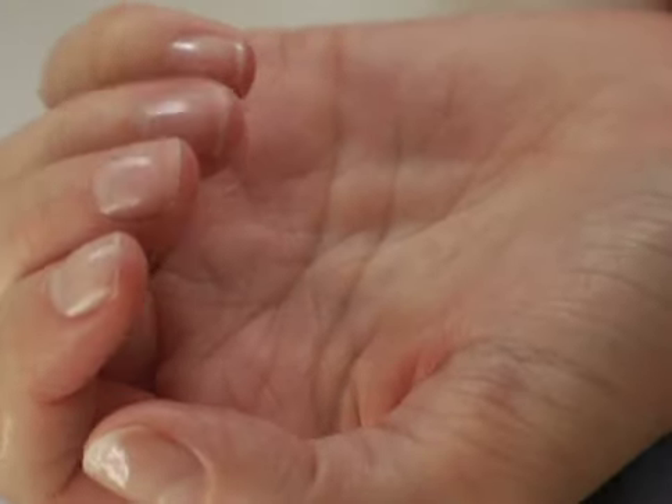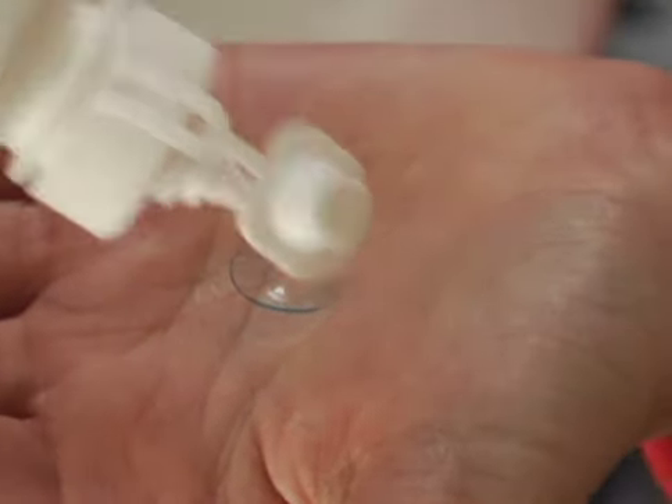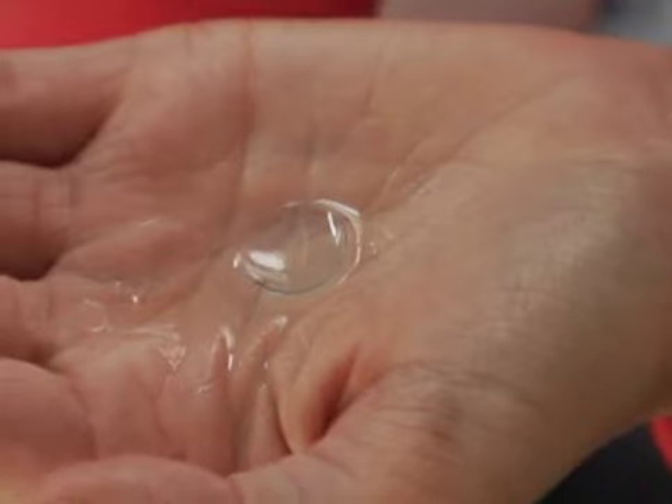Make sure never to use your fingernails to remove your contact lenses. After removing your lens, place it in the center of your palm. Add several drops of the multi-purpose contact lens cleaning solution recommended by your eye care practitioner to the surface of the lens.